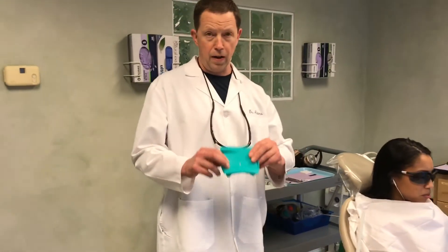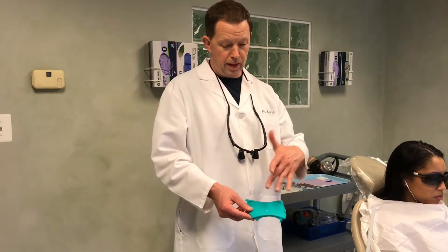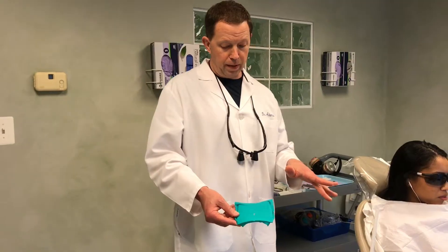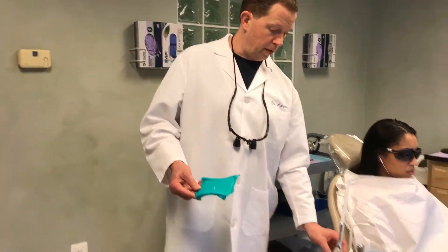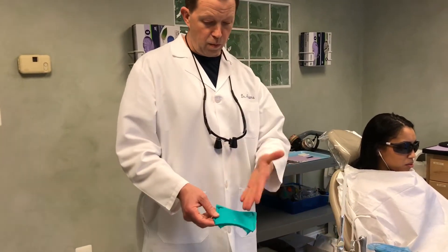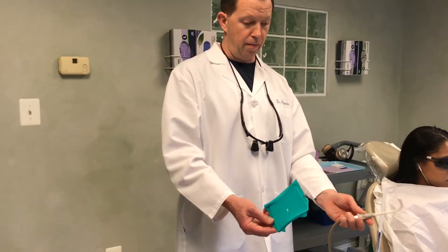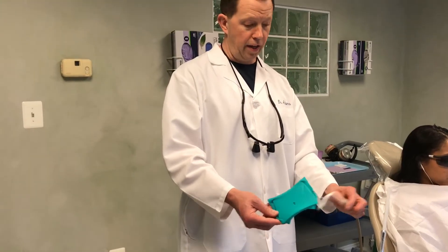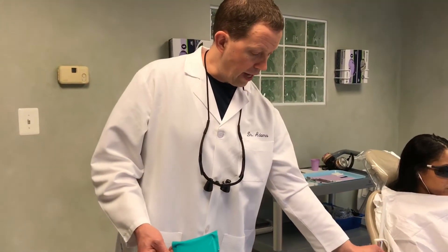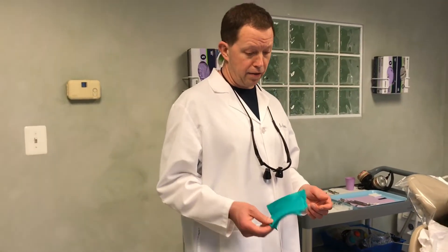We also have a dental dam — this is a rubber dam which goes around the tooth. This enables us to work inside the patient's mouth without having all the filling fragments flying around their mouth and down their throat. This is a high-speed suction that will be placed in the patient's mouth right behind where the fillings are being removed. We also have a low-speed suction placed behind the dam to capture any little particles or pieces that get underneath the dam, and it also helps remove saliva to prevent gagging.